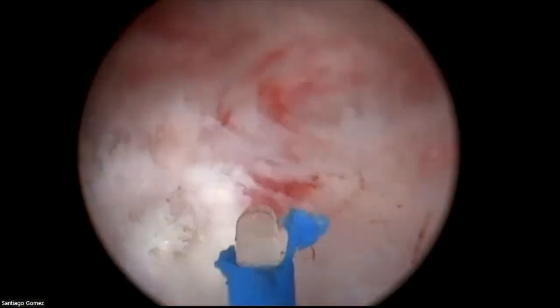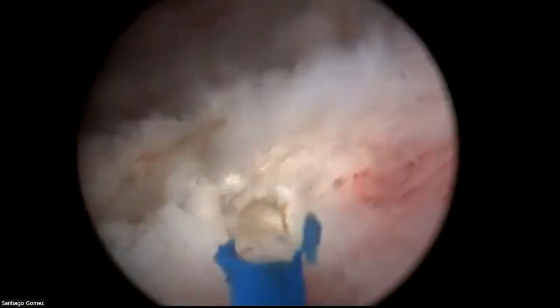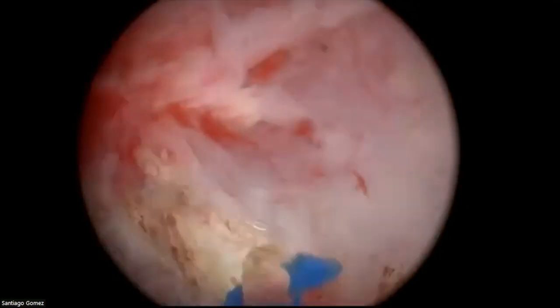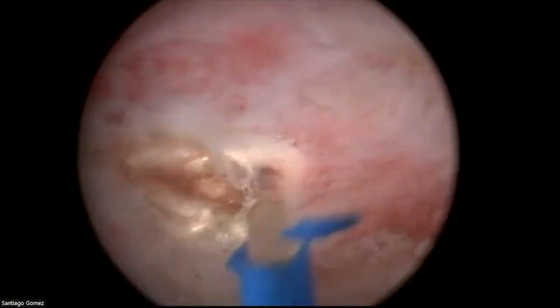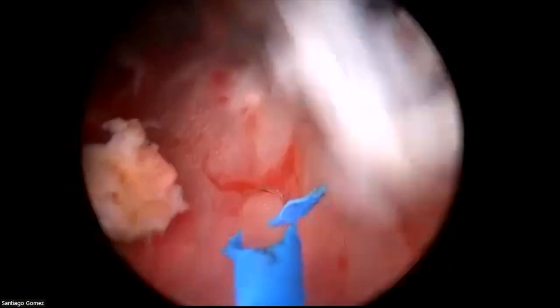Sometimes when you look back, and I will look back now to show you the sphincter, we see a perfectly preserved sphincter. Sometimes we see it's a little bit shattered or ischemic because of the movements in the operation. But if you follow these steps, even when you see that the sphincter is a little bit shattered at the end, endoscopically, the functional result is excellent. So let's see what we see when I come out.